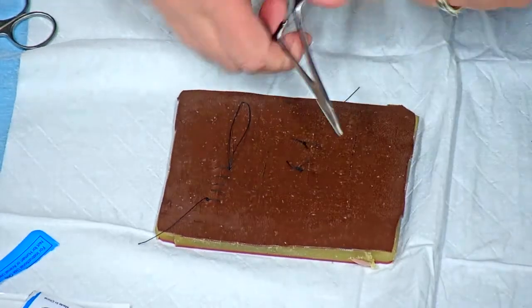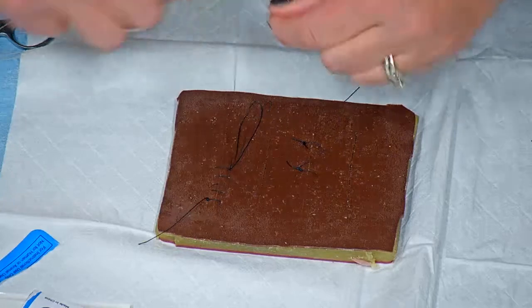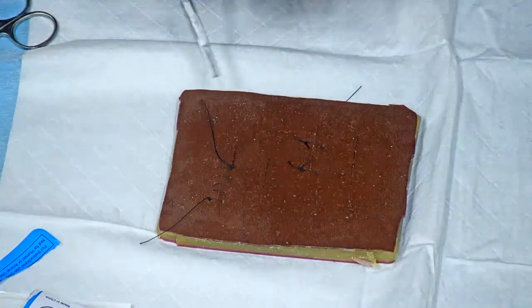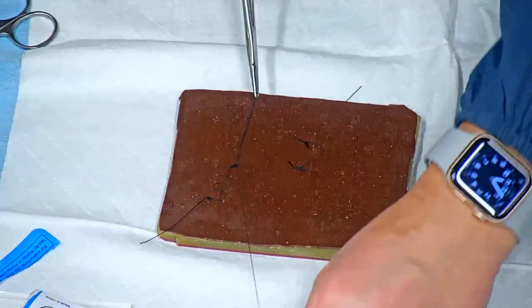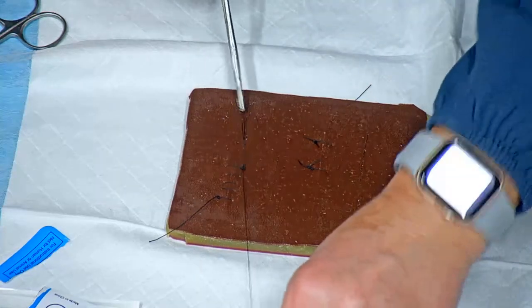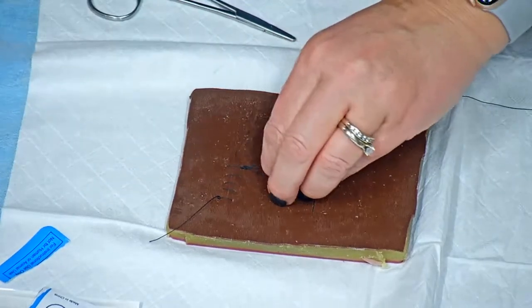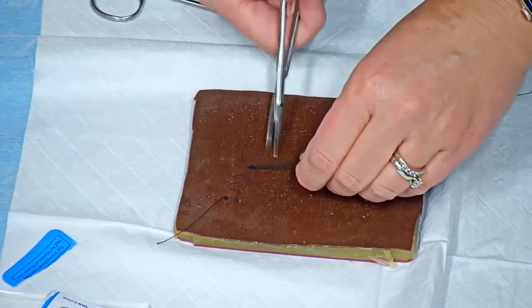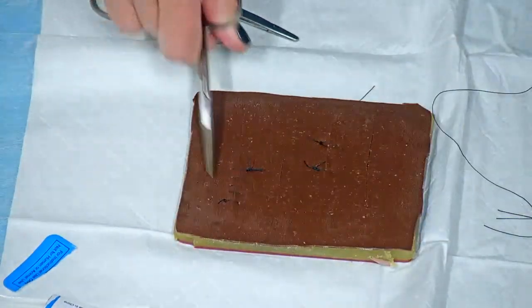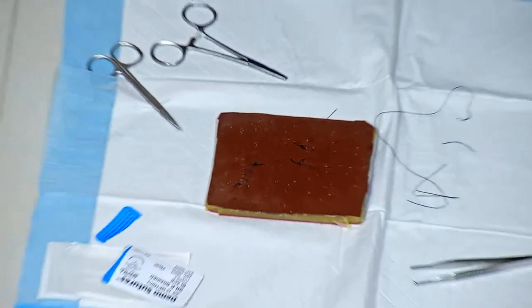then towards me. Grab at the top. We treat it as just one away. Then you can go ahead and trim all 3 of these. This side now, and that is your continuous running. So I would encourage you to take some time now and go ahead and practice these different sutures.